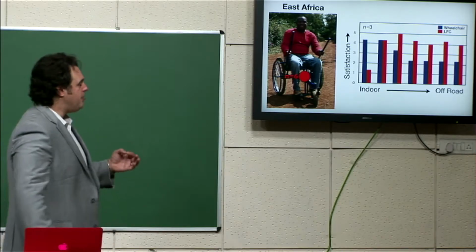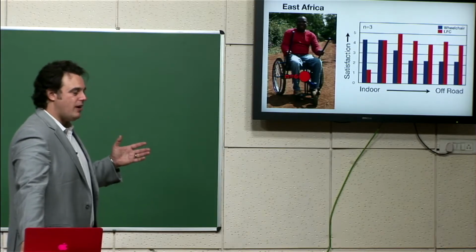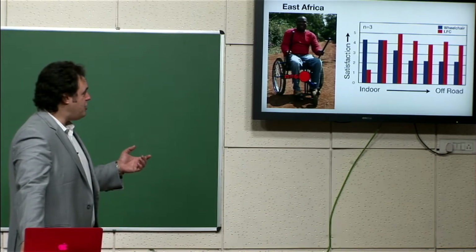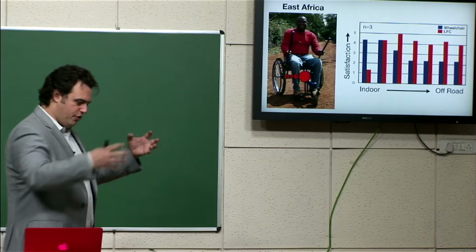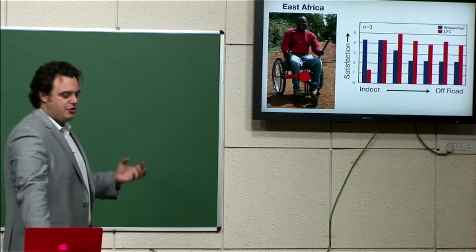And all 6 people in this trial said, this chair is way too heavy for us to use. It's about 20 pounds or about 10 kilograms heavier than our standard wheelchairs. So we have to somehow make it lighter. And this is a significant challenge because our drivetrain weighs about 12 pounds. Right? It's pretty heavy, like all those mechanical components to drive the lever system. So somehow we have to make a lighter frame and a lighter chair.